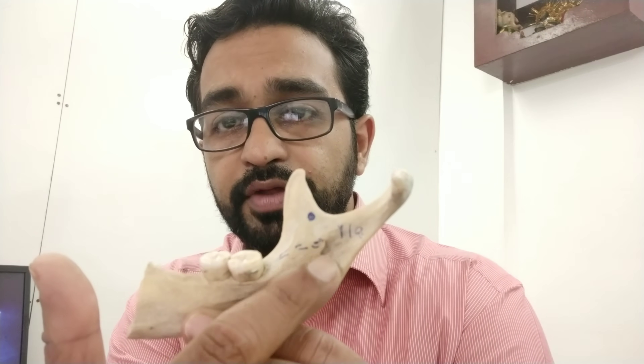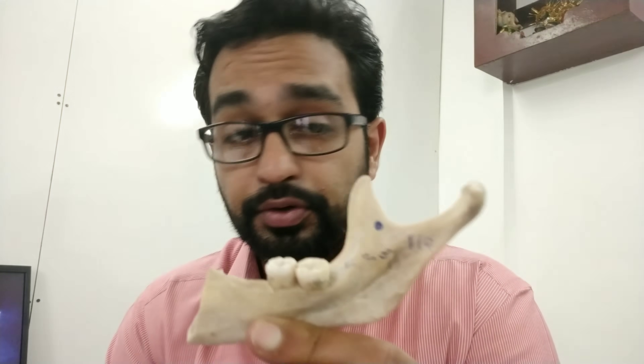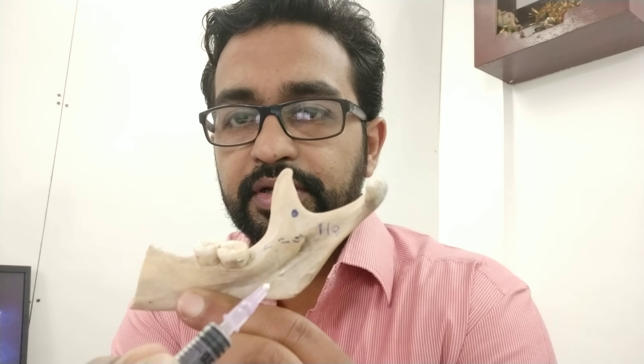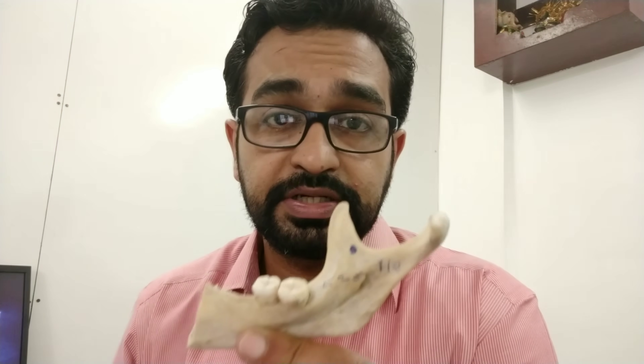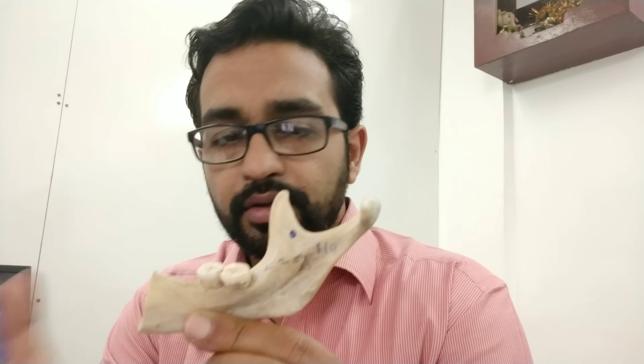The most important part of giving a mandibular nerve block is that the bone must be contacted — this is very important. Do not inject if you do not hit the bone. If you go too posteriorly, the needle can enter the parotid gland, where the facial nerve (7th cranial nerve) lies, causing transient facial paralysis. If you go too anteriorly, the local anesthesia will not work.